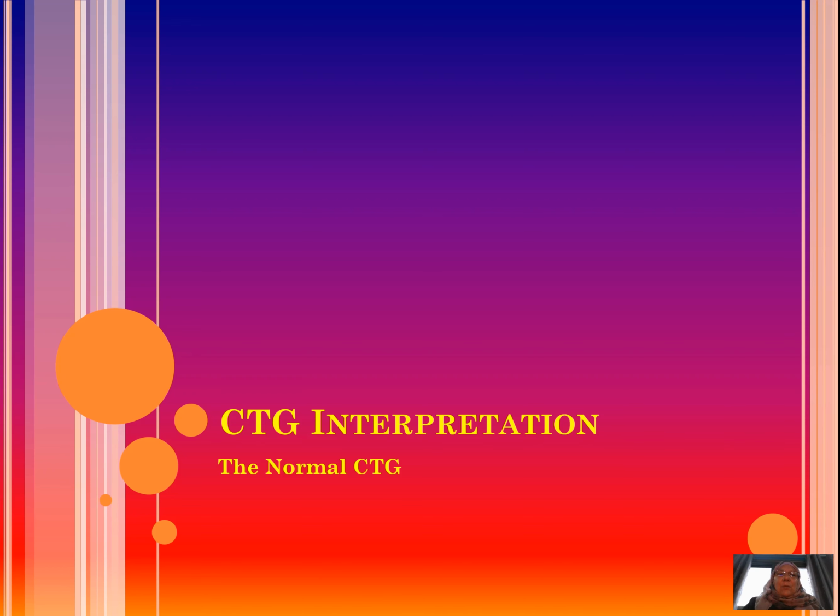We will have two lectures on CTG interpretation. This one will focus on how to recognize a normal CTG, and then the second one will look a little bit more at the abnormalities associated with CTGs or found on CTGs.